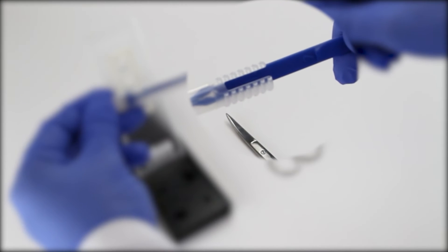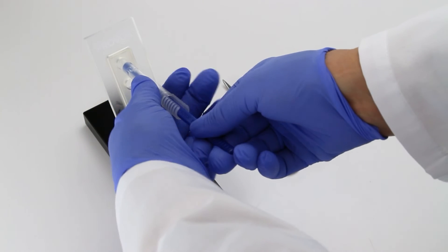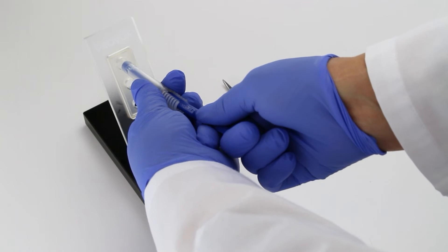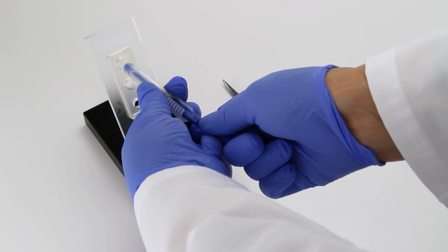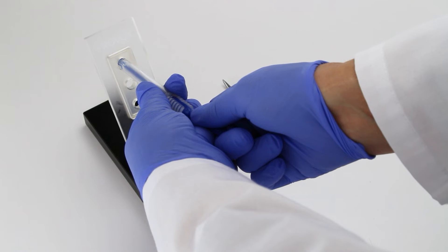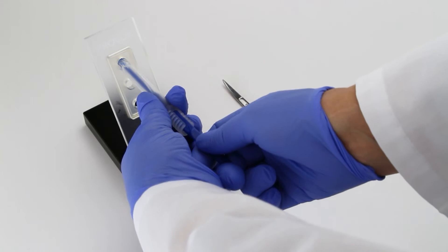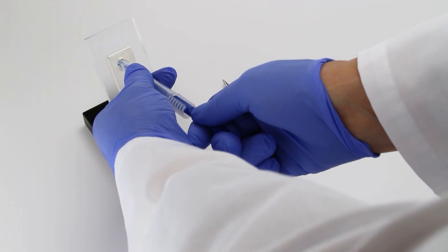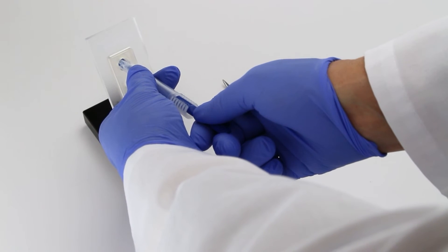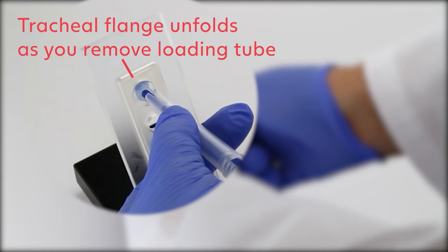Advance the prosthesis with the inserter pin until the active valve reaches the base of the tapered tip at the end of the clear loading tube. The line marked 1 on the inserter pin should now align with the bottom edge of the clear loading tube. Gently insert the loading tube into the TE puncture until the tip of the tube is completely inside of the puncture. Insert the prosthesis by holding the loading tube stable with one hand and pushing the inserter pin forward with your other hand until the line marked 2 advances to the edge of the loading tube. Pull back gently on the loading tube and inserter pin until you feel the esophageal flange of the voice prosthesis reach the anterior esophageal wall. You will see the tracheal flange of the voice prosthesis unfold as you remove the clear loading tube.